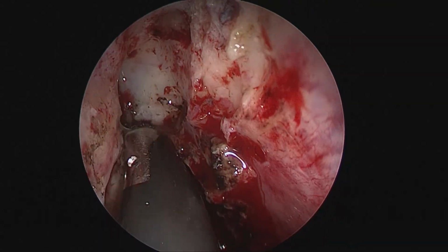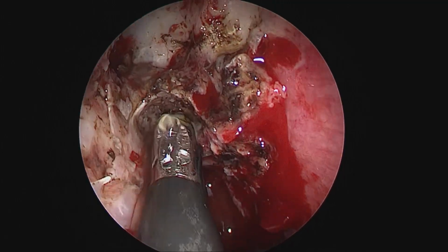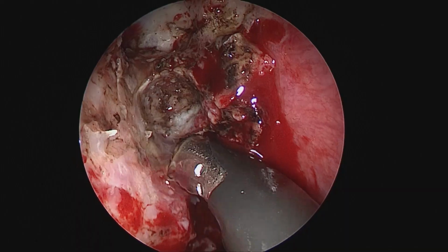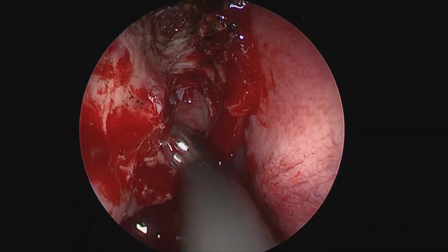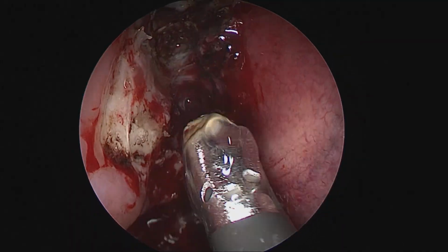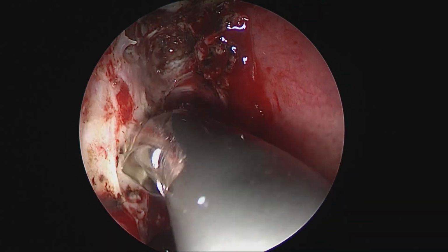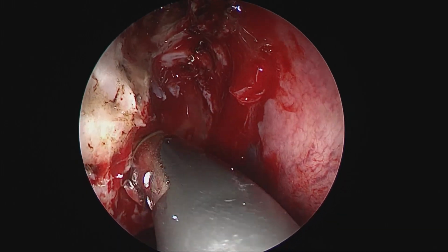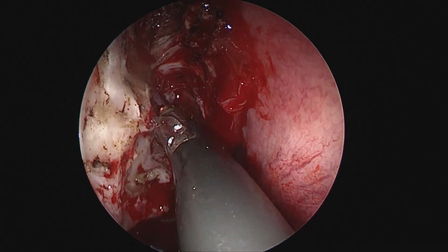You see here how we are taking all the time to completely bare the bone, ablate all portions of even suspected diseased mucoperiosteum, right from the lamina papyracea to the skull base, the ethmoidal roof, and to the superior portion of the septum, and not leave any shreds of tissue here. So one has to be clear in not leaving behind any disease, because even a millimeter of actual neoplastic disease left here could lead to recurrences.